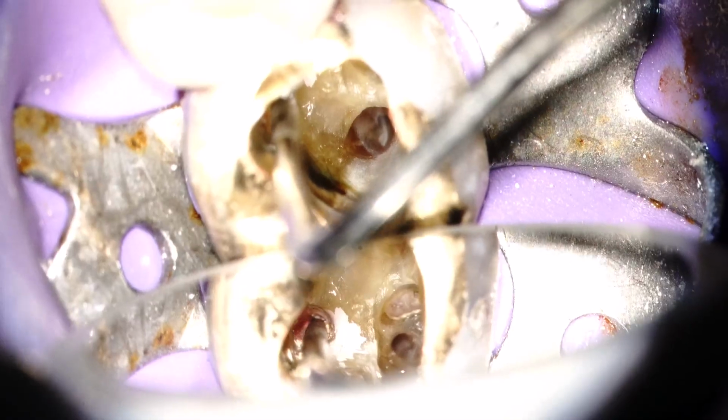Now in this case you're going to see this is the vertical compaction of the warm gutta-percha technique. I usually do 5 waves of compaction. This is the touch and heat applied for 3 seconds, and then I compact with the number 9 Schilder plugger, and I can see the cement escaping along the sides of the cone. I'll go back in and repeat.